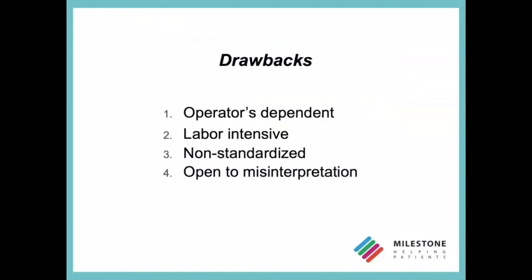These procedures are therefore subjected to limitations. They are strongly dependent on the ability of the operator for both description and even more for sketching the biospecimen. Clearly, not all the pathologists have the same drawing skills.